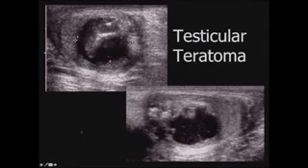Testicular teratomas are one of those lesions that you can start to consider as a diagnosis. You can often see mixed solid and cystic tumors. Sometimes you can see the calcifications within it. These are always benign in prepubertal patients, but when you have a patient in puberty, there's a much higher incidence of having some mixed malignant elements.